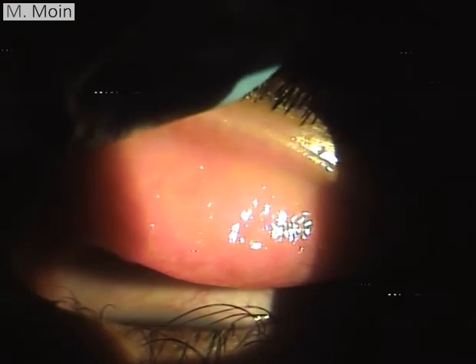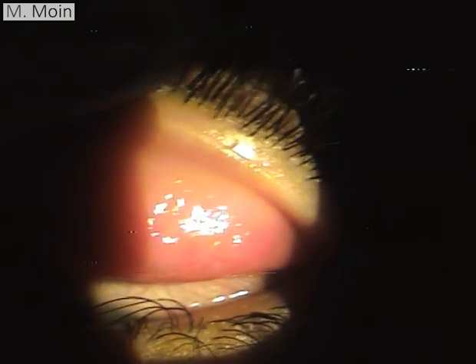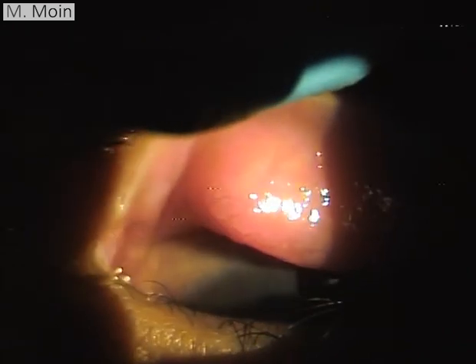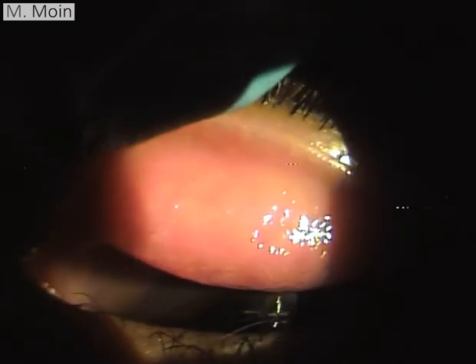It is very important to look at this with diffuse illumination. You need to dim the light down slightly and then look first at lower magnification and then at higher magnification to see what is present.